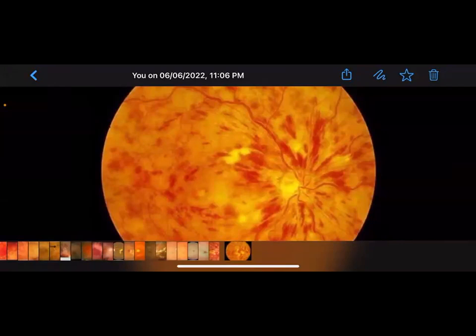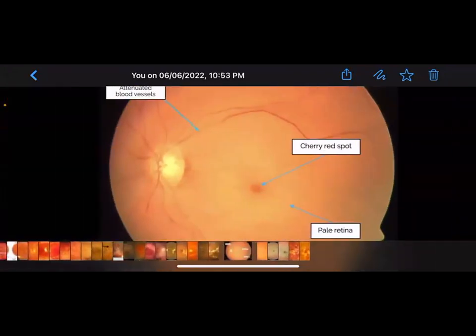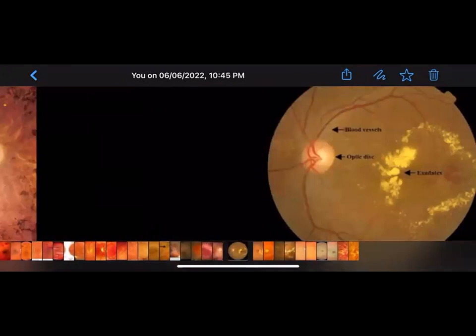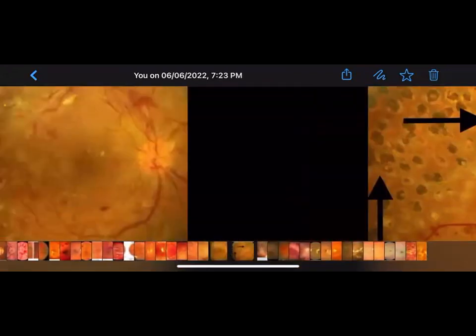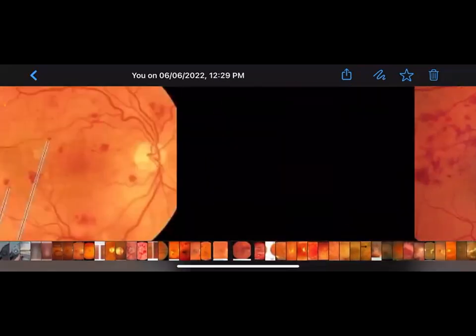Okay. So thank you so much. Findings were cataract on the left side. On the right side, the pupil is irregular. There's an implanted lens in the anterior chamber of the eye, and there is proliferative diabetic retinopathy, and the patient did laser therapy. I mentioned everything except the implanted lens. I missed this. I could not see it in the exam, but they wrote it in my feedback.